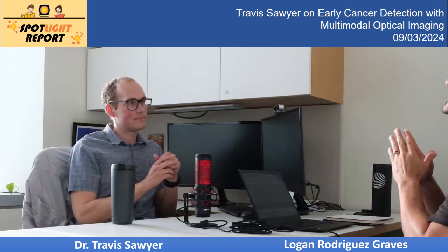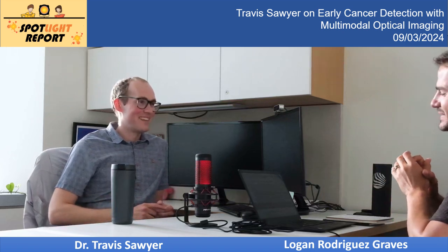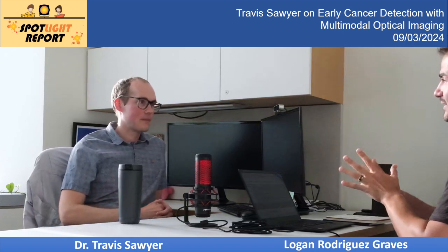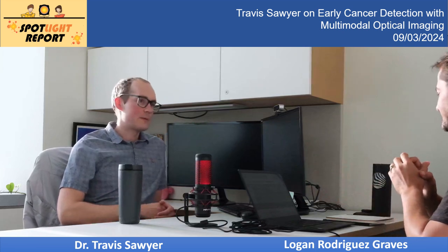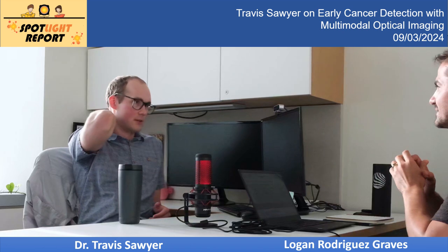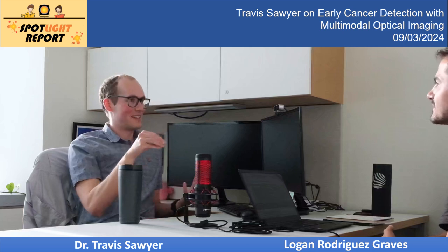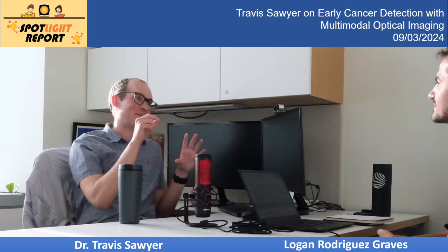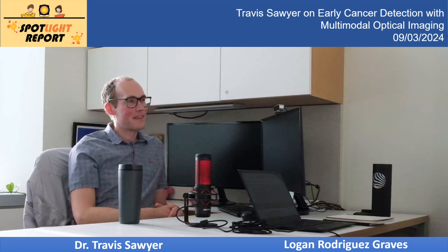Yeah, and headache, I would say. Yeah, to be totally frank, right? I don't know if you can say that, but I definitely have this memory that getting an IRB-approved study on humans is a lot of work. So you need a lot of evidence. But trust me, it's really worth doing this. So absolutely, especially when you're putting a device into a person. I think it's great if you can leverage existing technology. So like esophageal, a lot of our devices are meant just to fit in the working channel of an existing endoscope, and that makes this much easier because you're not really putting anything new into the body. You're just putting it into something that's going into the body. Right. So yeah, it's amazing. That big headache, I think.